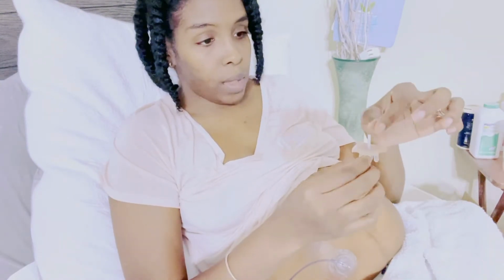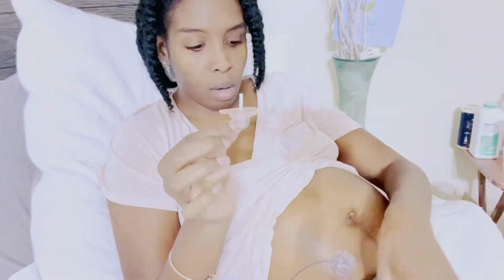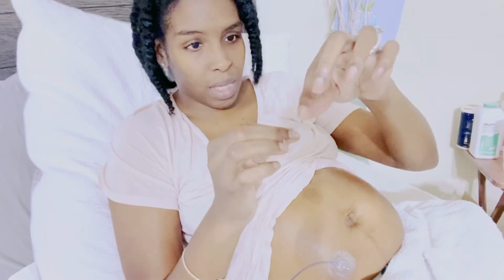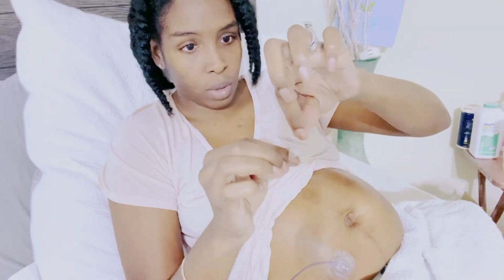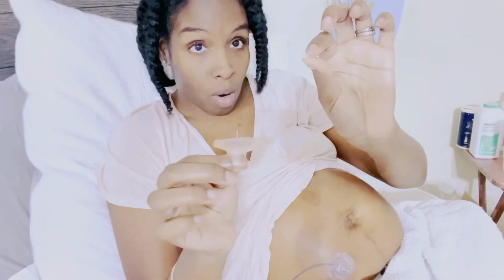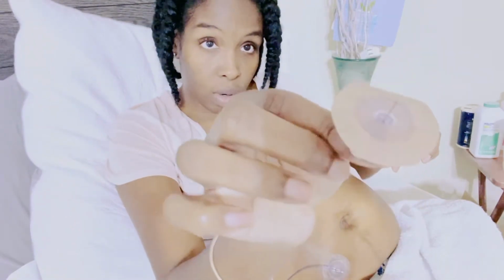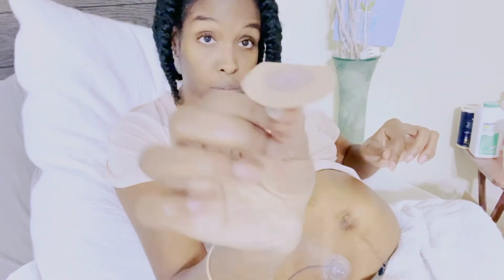Now I'm just going to take this little cap. Do not stick yourself. Sometimes it's kind of hard, so be careful. See, took that off, and I'm going to put this in my little container. So that's the needle, y'all. It hurts to me.